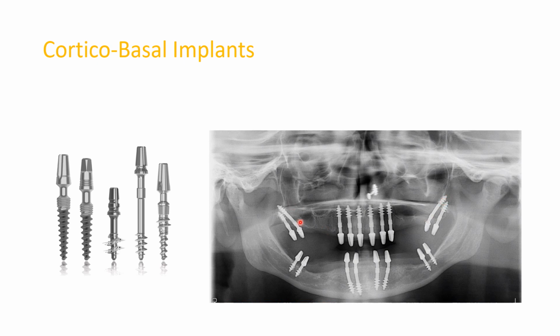Same over here. And then these implants can be bent, they have a bendable neck, so basically after placement they can be bent to make them slightly parallel to each other, and can then be immediately loaded. They need to be immediately loaded in order to splint them, because they have low primary stability, since they don't have aggressive threads all over the body. They only have aggressive threads at the tip, that is engaging the second cortex.